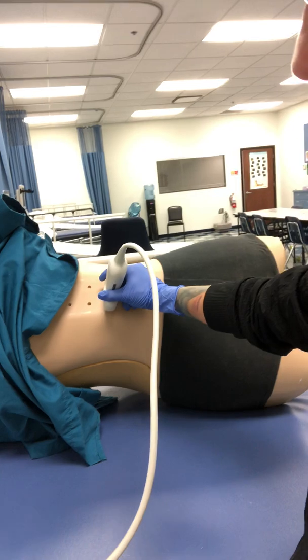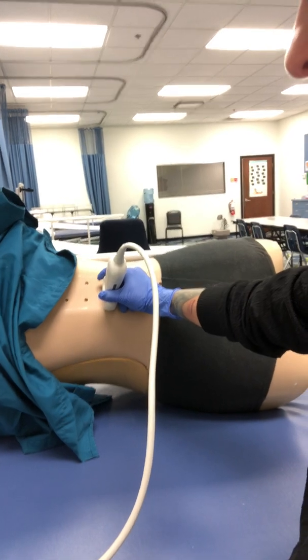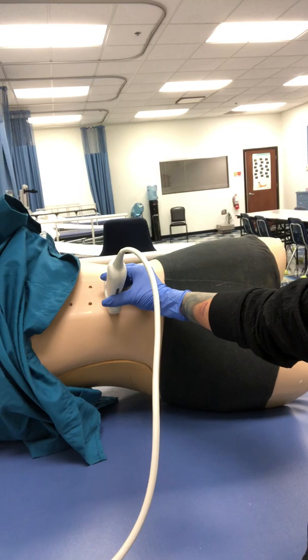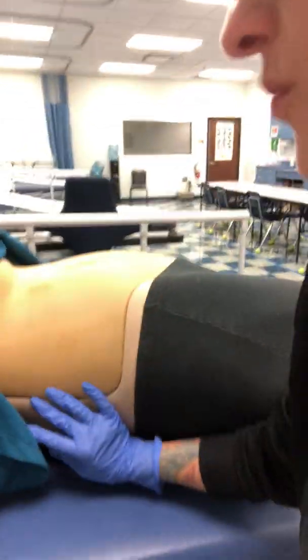So again, if we're going through posterior to anterior, our notch is pointing towards me, or in this particular case, the patient's left-hand side. And again, that would make the opposite side true on the screen. So that would mean the right side of our screen is now correlating to the patient's right. So again, roll Betty over.